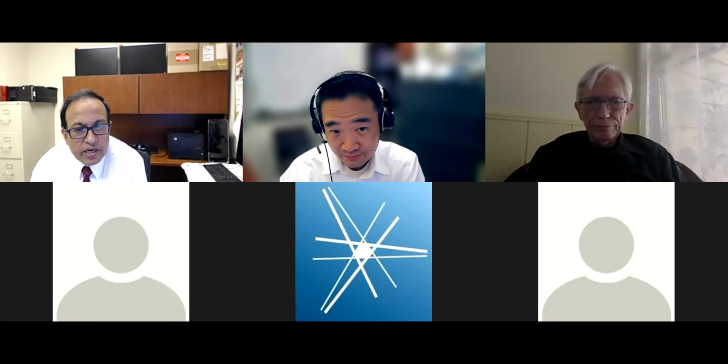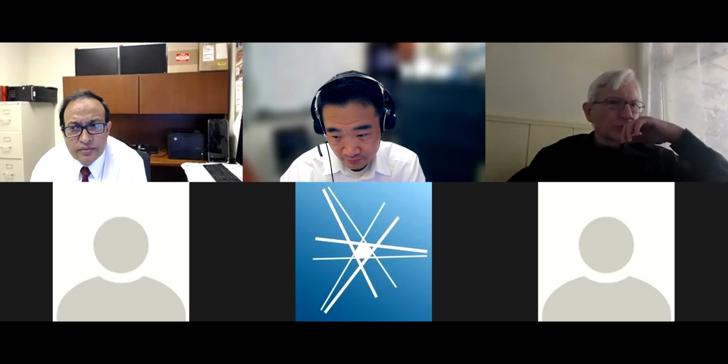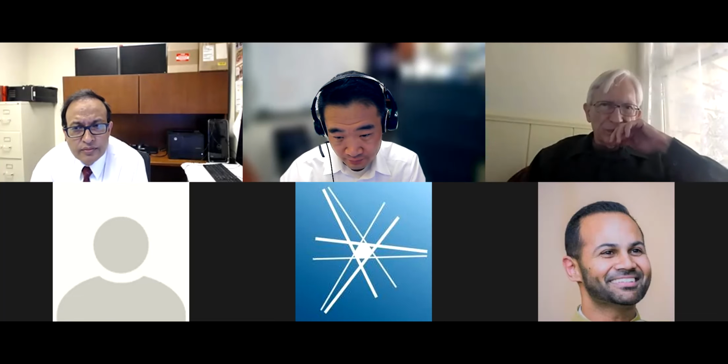Are you extending it to flash therapy? Mukim, we are, aren't we? Or Sam? I thought we were. Yes, we have a group that's evaluating flash therapy. Absolutely. Okay.